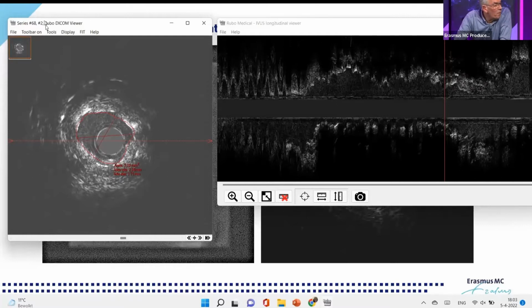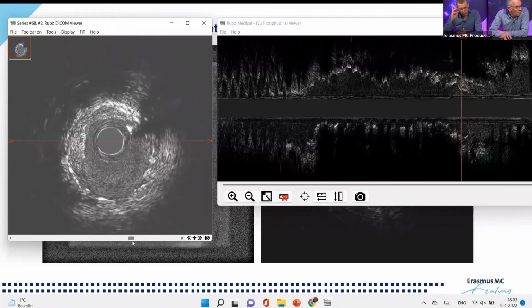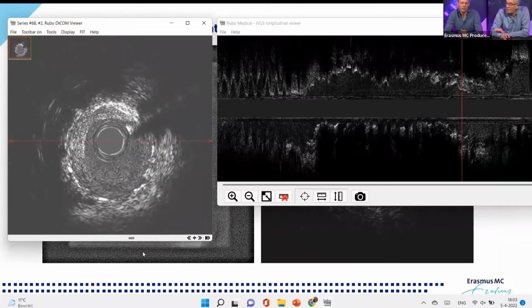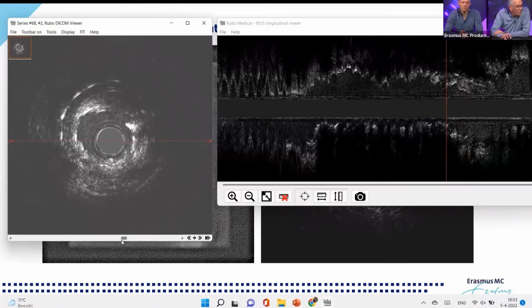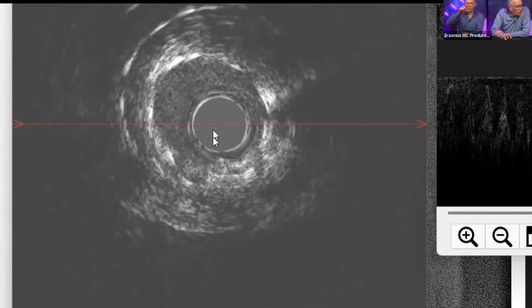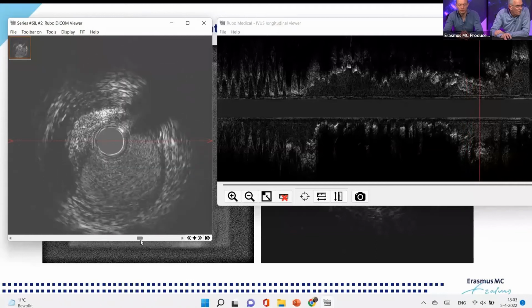And again, you see us measuring all these lumen areas now just for the sake of demonstration. But you will find in your routine practice that if you use imaging more and more, you really will get a carpenter's eye. So there will not be much need to measure the exact area. In this case, it is relatively straightforward to recognize this frame, and maybe you can show it again, Jürgen, as severe underexpansion. I mean, the lumen area should be rather consistent throughout the stented part, and in this case, it's clearly not. You can always take the catheter, which is the gray circle in the middle, which has the exact diameter of 1 millimeter. If you keep that in the back of your head, you always have a proper reference to address the lumen area or the diameters of the segment of interest.